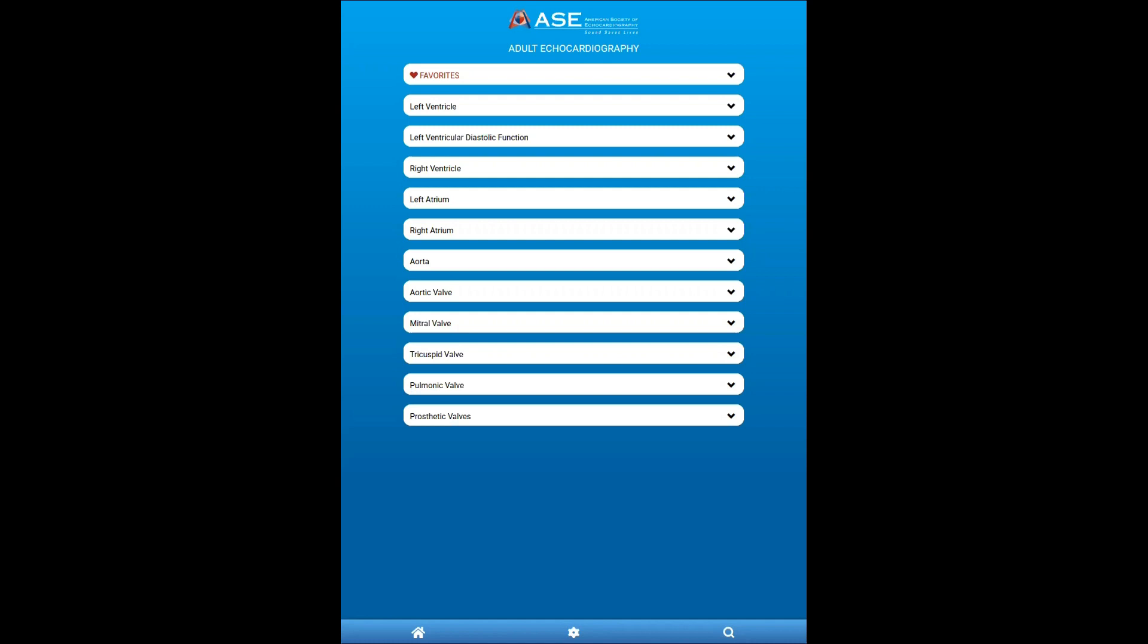So at this point, I will demonstrate the different tools and functionality of ECHO Guide. And as you can see, the main screen here is fairly intuitive.